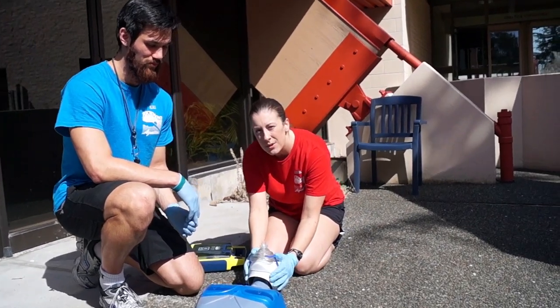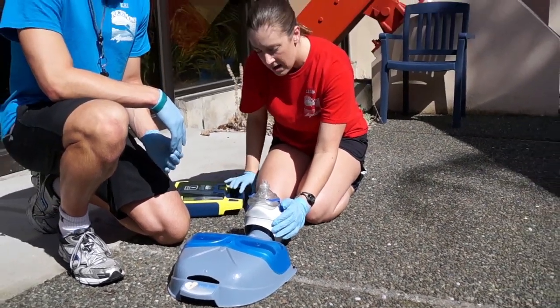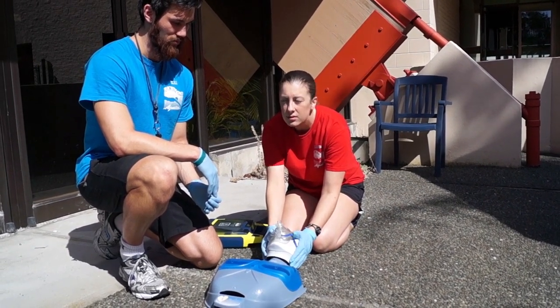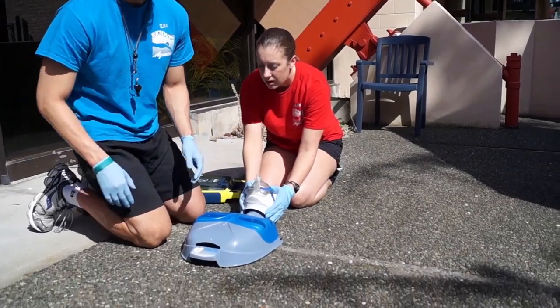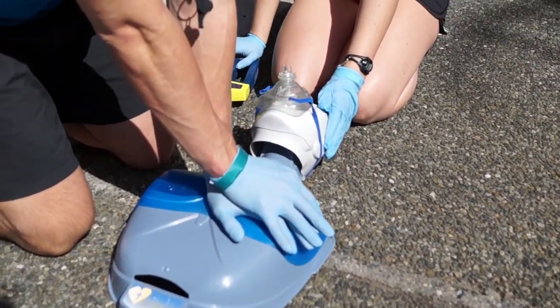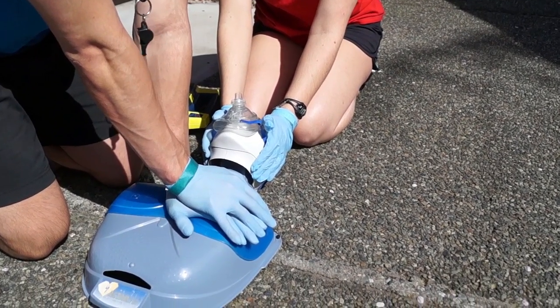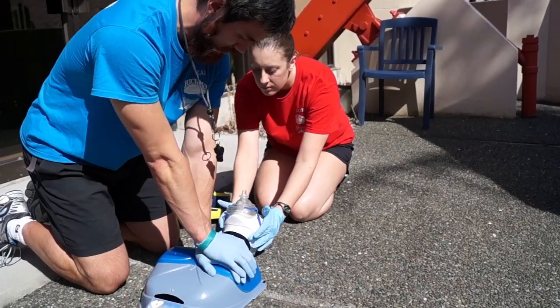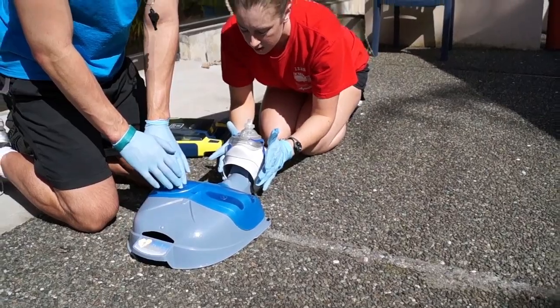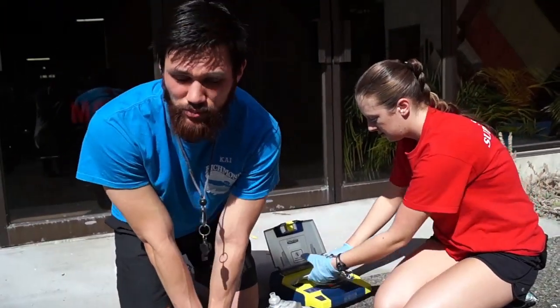So this is a pocket mask with a one-way valve. It protects the rescuer as well as the victim. We breathe through the mask and give the victim air. After we deem that our patient is not breathing, we go straight into chest compressions. It'll be 30 compressions to 2 respirations. For an adult, it's approximately 2 inches deep. In a real life scenario, you just have to push hard. So 1 breath, 2 breaths, and then you would continue doing 30 compressions to 2 breaths.